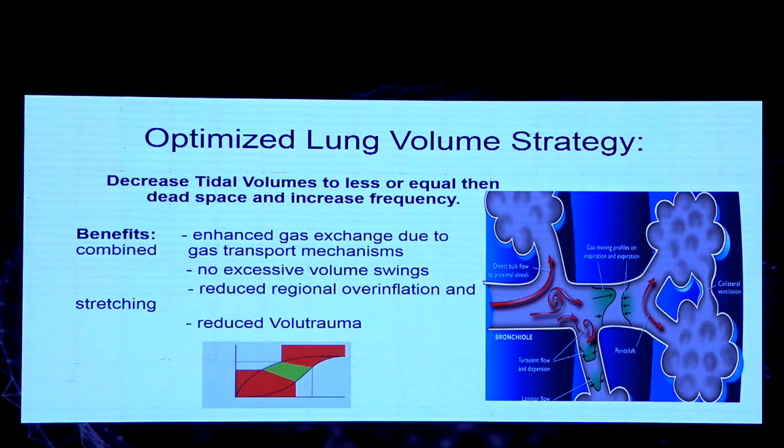The benefits of decreased tidal volume usage, less than or equal to dead space, in high frequency results in enhanced gas exchange due to gas transport mechanisms that are just different than conventional ventilation. There are no excessive volume swings, and there is reduced regional overinflation and reduced volutrauma.